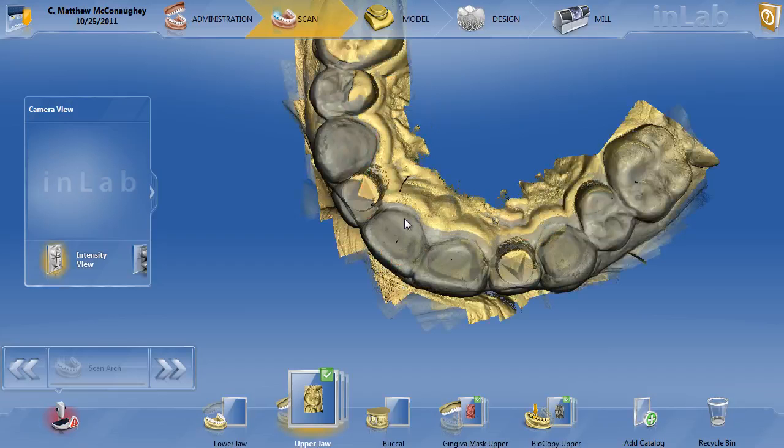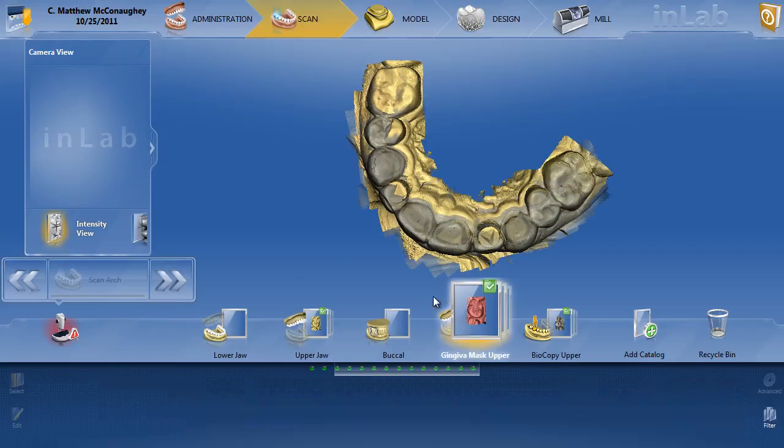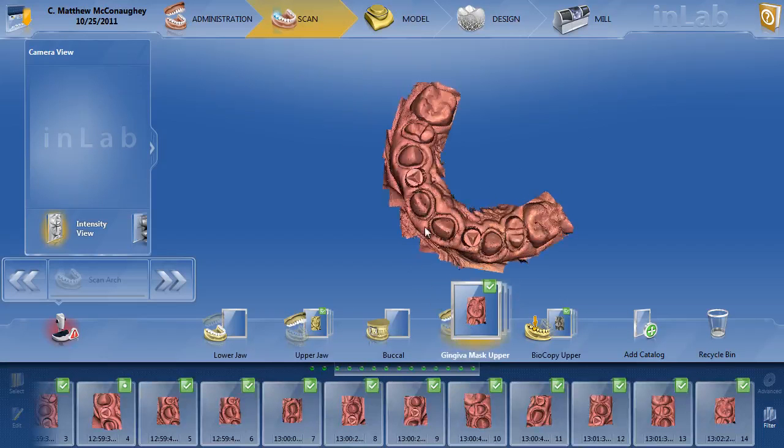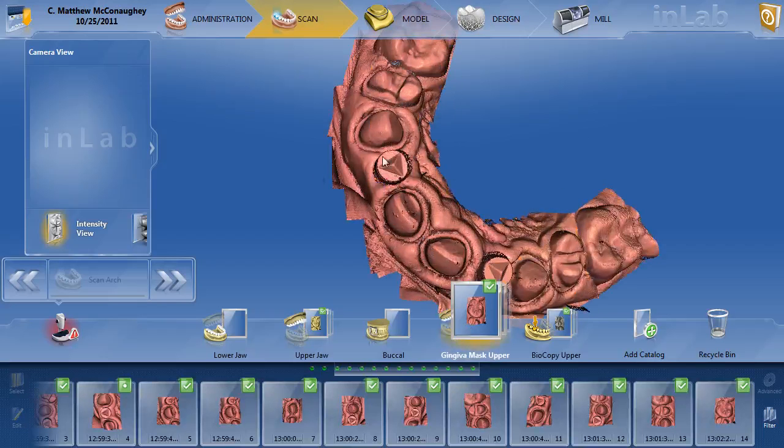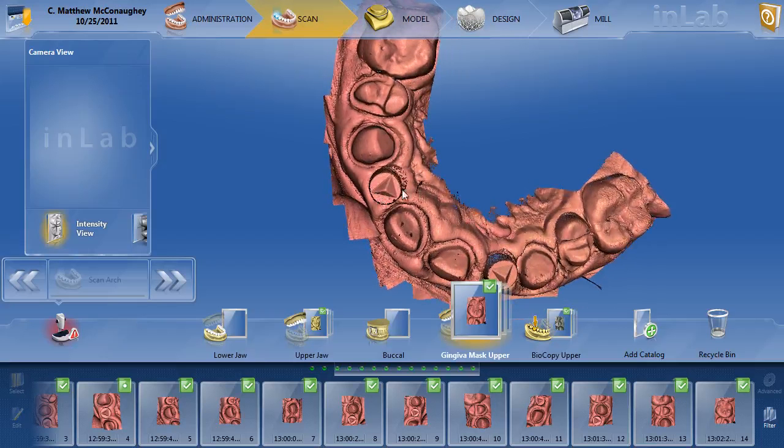You can see the two scan bodies here on the lateral incisors. He didn't take a lower jaw or a buccal bite, but he took a gingiva mask to record the tissue. The only thing I would do differently is I tend to take the gingiva mask without the scan bodies in. It looked as if he copied and pasted the upper jaw into the gingiva mask. With posteriors you can get away with this more than anteriors, because the posterior gingiva is much more outside the level of the scan body. Here on the anterior with the scan body in, it's much more difficult to see the outline of the actual crest of the tissue, so I would have taken the scan bodies out.